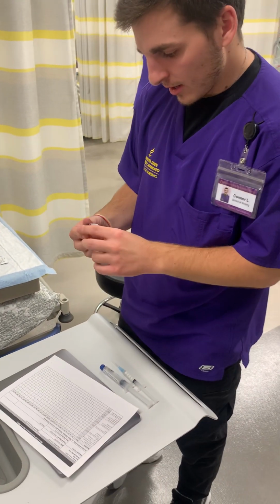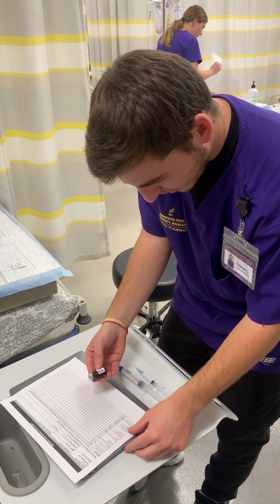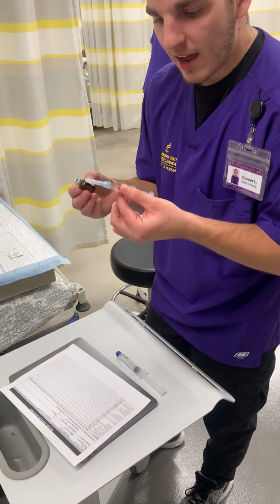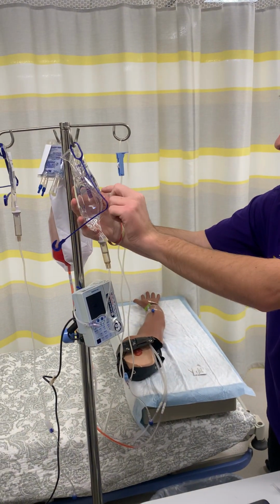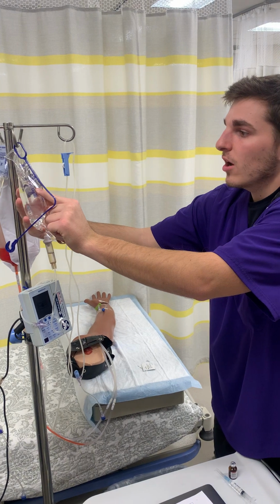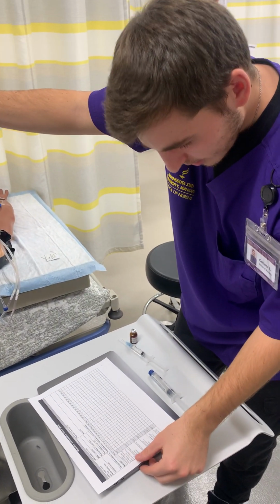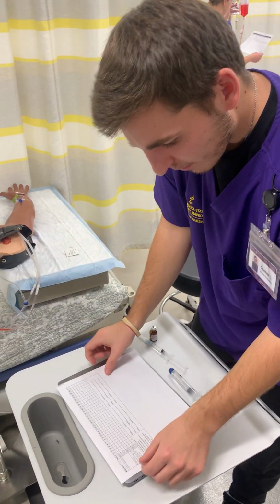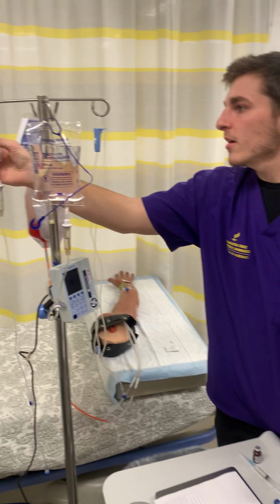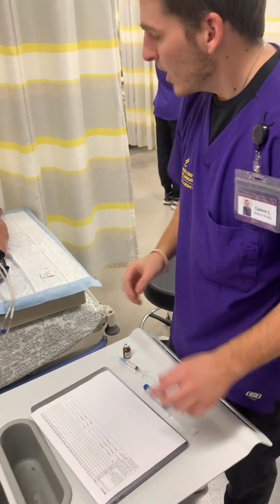So I'm checking, I brought in our dexamethasone, and I'm just rechecking to make sure that we do need 2.5 milliliters, which we have. And I'm checking the bag. It's 500 milliliters of sodium chloride or normal saline, and I see that on here. As well as we have levofloxacin here, 500 milligrams. So everything looks good.